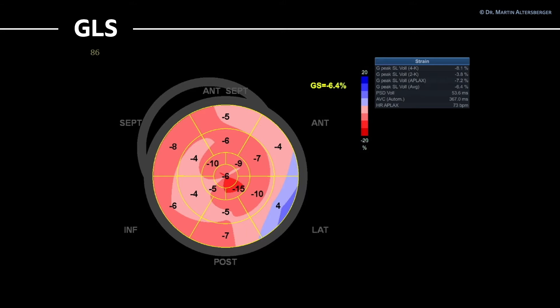Taking a closer look at the bullseye display, we see in the lateral wall a blue or bluish area — some parts even darker blue — indicating dyskinesia. The lighter red colors represent severe hypokinesia. Moving towards the apical segments, the red color becomes slightly darker. The highest value in this bullseye display is minus 15, which would be borderline or mildly reduced strain. So the typical apical sparing pattern seen in amyloidosis is not really present, though the apical segments do appear to contract a little more.